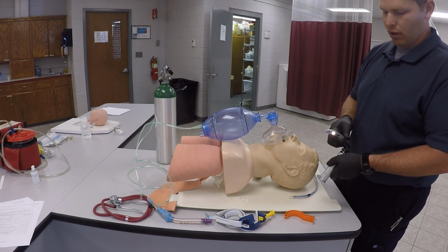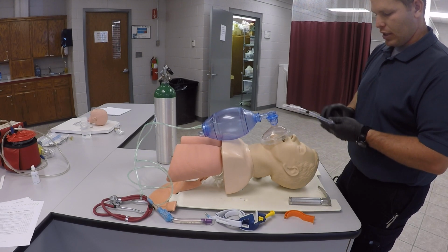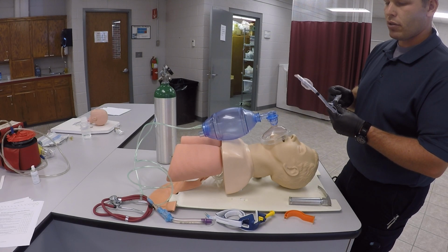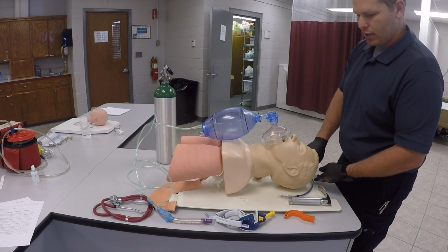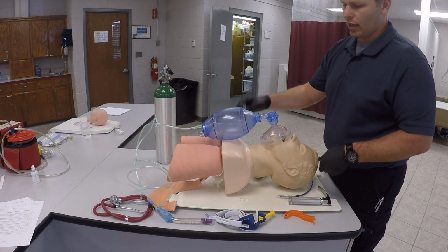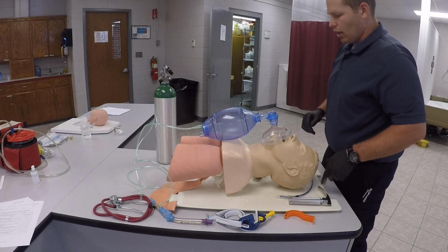So we're going to check our equipment here. Our laryngoscope blade is white, bright, and tight. And our ET cuff here is holding air. There's no leaks. It's properly sized, everything like that. And then we do have all of our extra CO2 devices. We have a backup airway if necessary. We've got securing devices, everything like that.